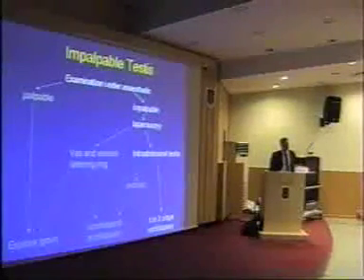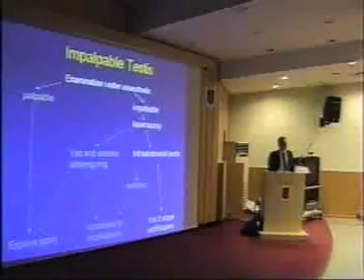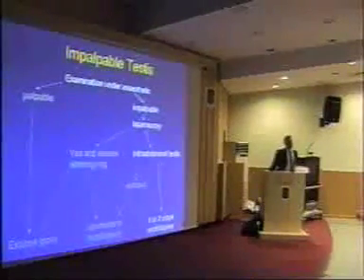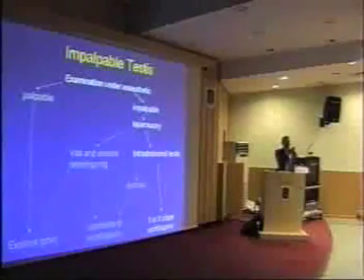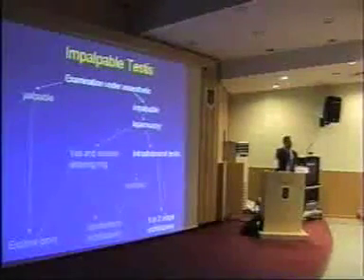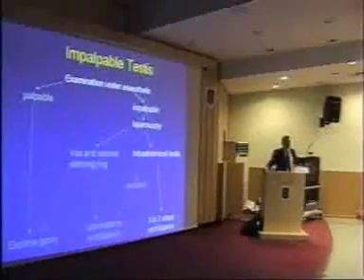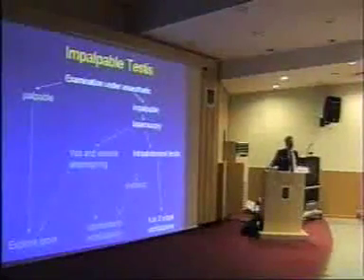What I found was that when I switched to retroperitoneal nephrectomy, and there's a video on a disc that I think you'll see of the operation that I did here last year, retroperitoneally, it was actually easier in many respects. When you come to the kidney from the front, the vessels are in front, the ureter is behind. You need to move the colon off, and mobilizing the colon off the front of the kidney, particularly on the left-hand side by the spleen, can be quite difficult transperitoneally. If you do it retroperitoneally, there's no issue with the spleen.